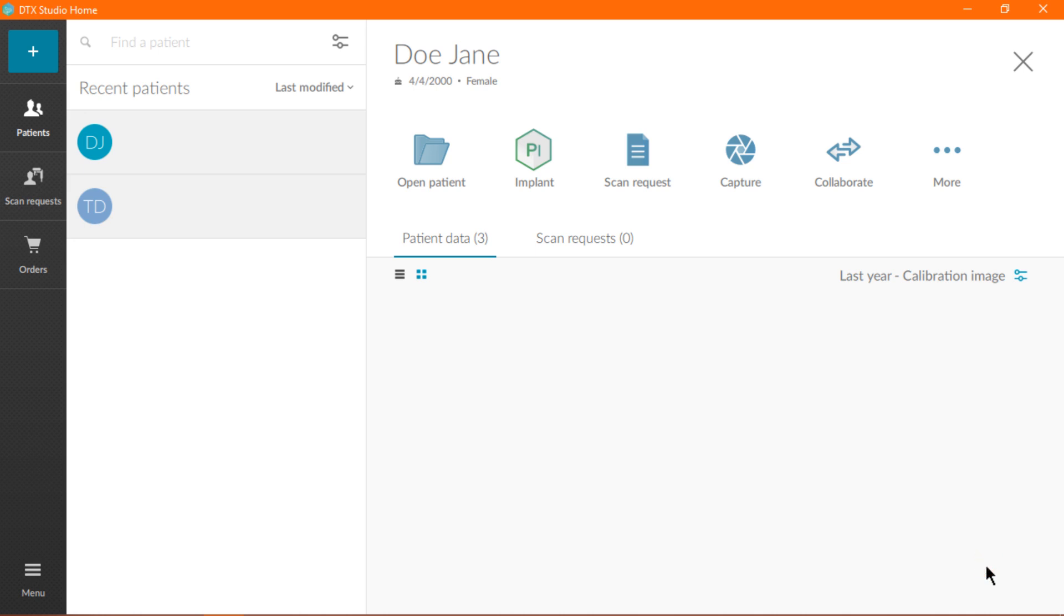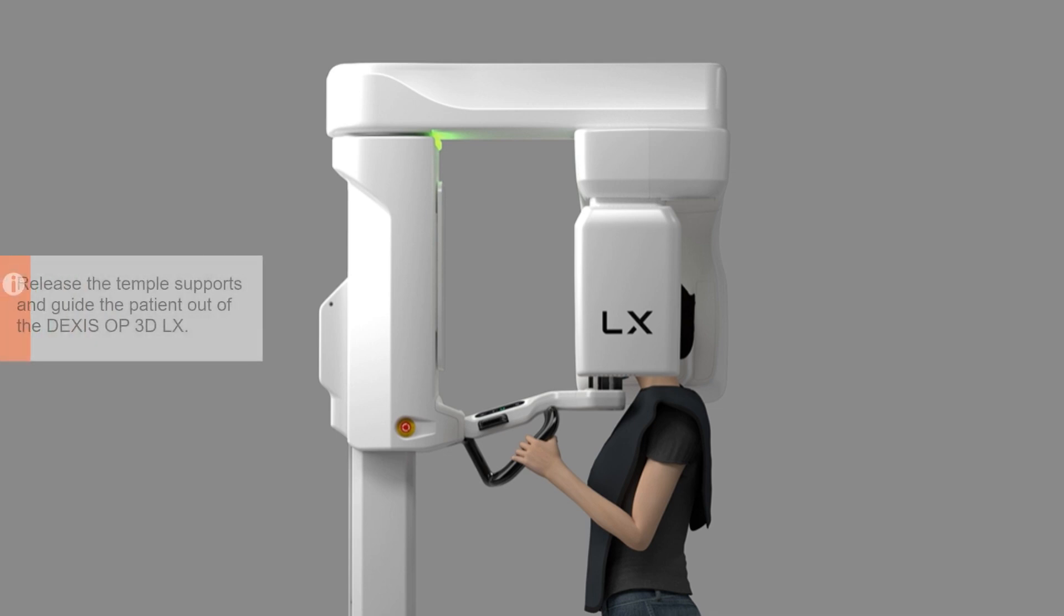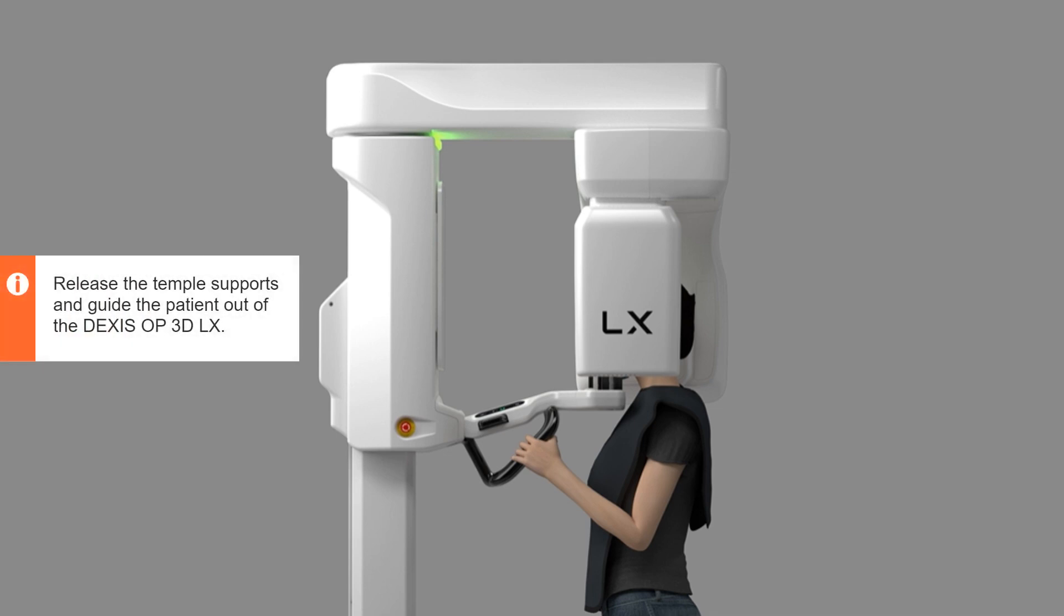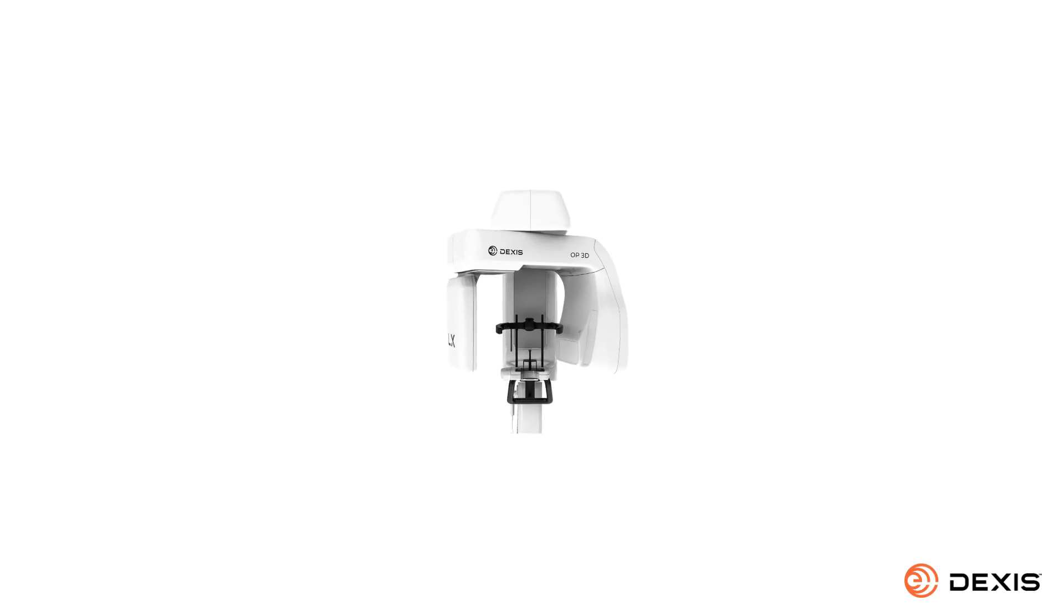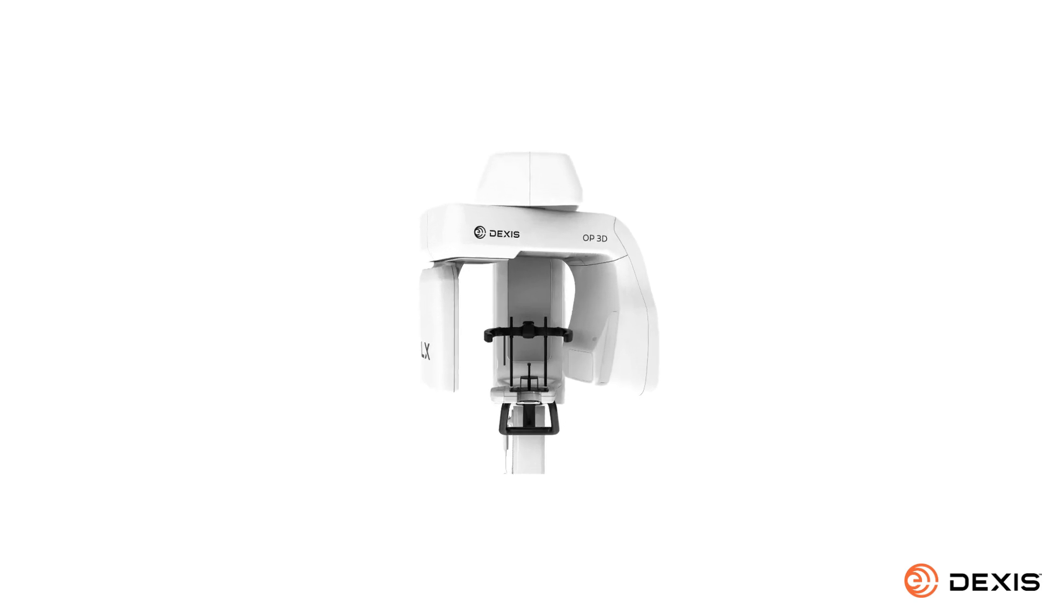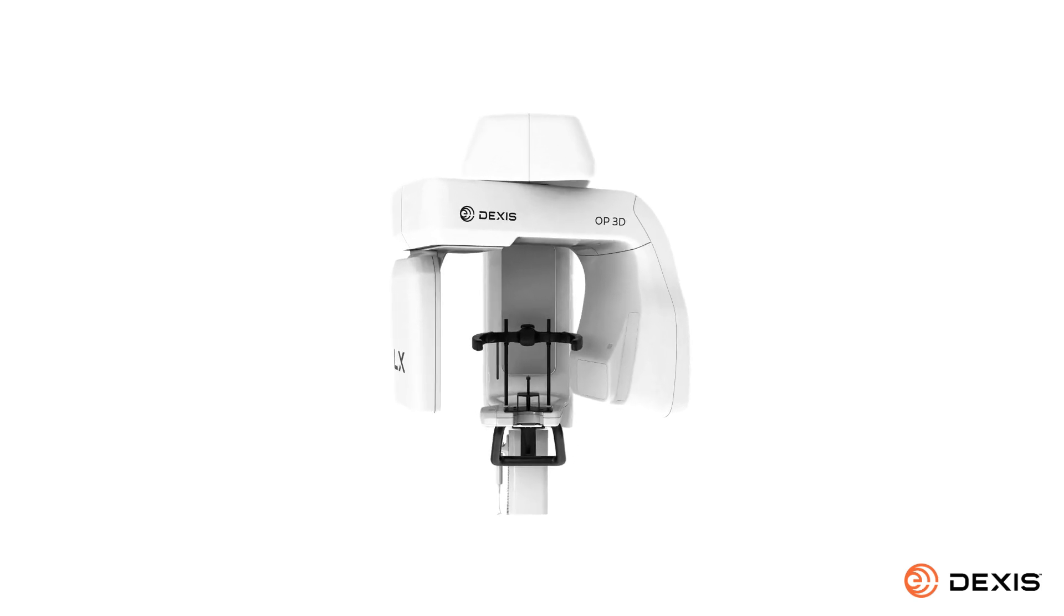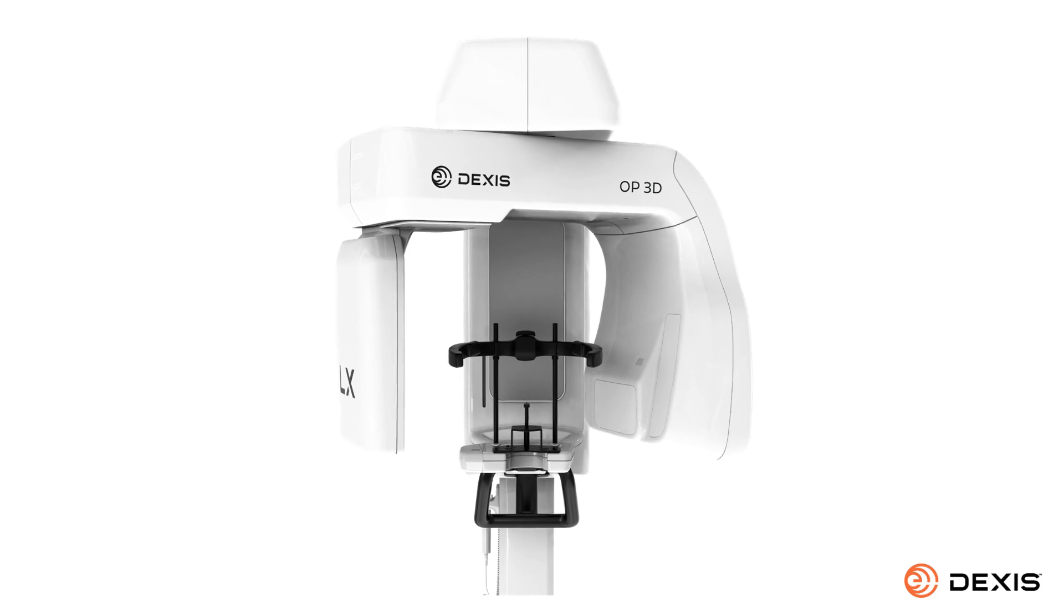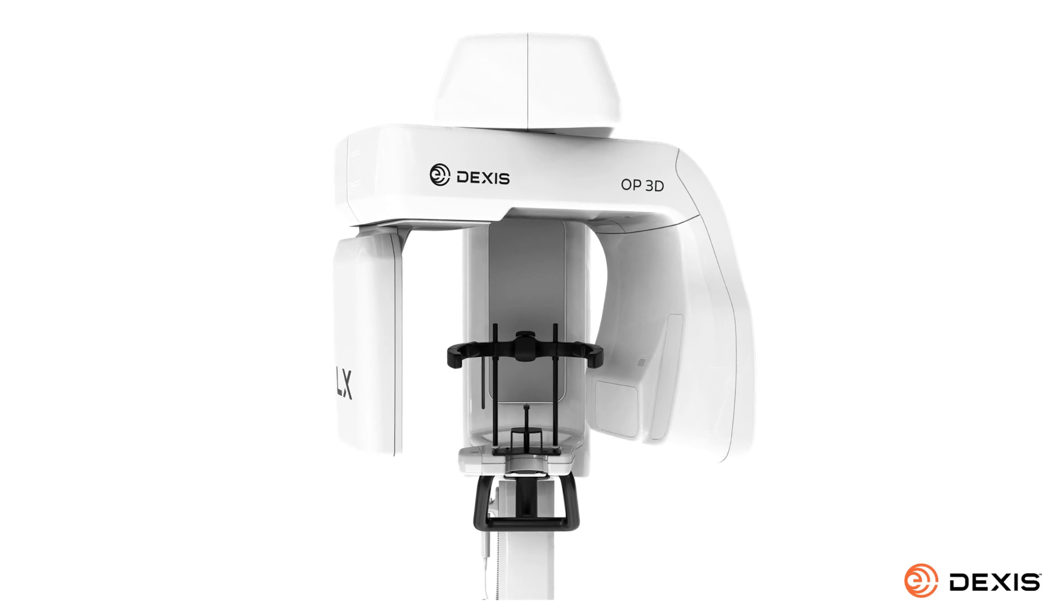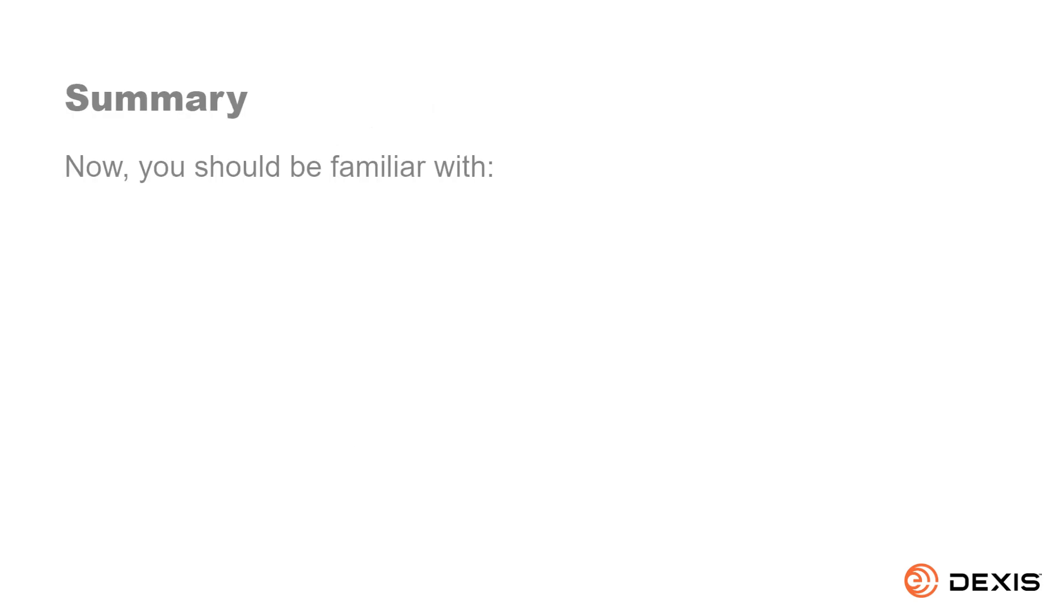You are now finished. You can now release the temple supports and guide the patient out of the DEXUS OP3D LX. Remember to remove all disposable covers and decontaminate the device and the patient positioning accessories.